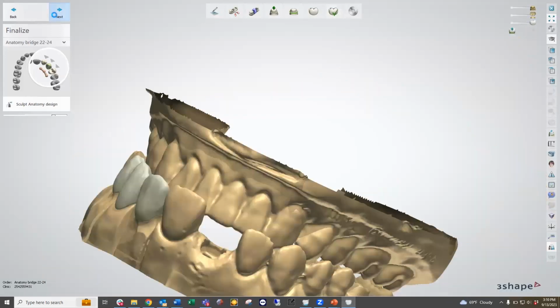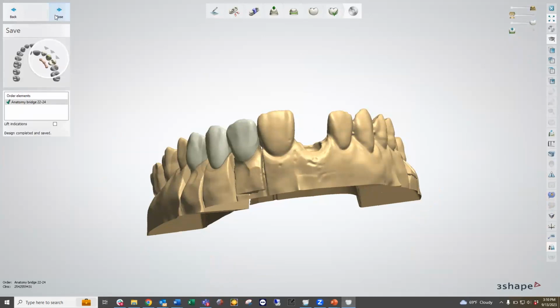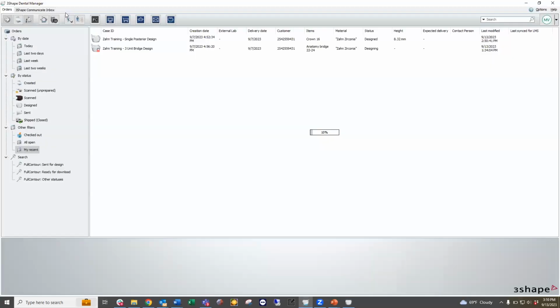So after the bridge is done, we hit next. It's going to again analyze to make sure there's no issues with the unit itself. If there's any issues, it will present itself at this time, and you have to make those adjustments in previous stages. Once we're all done, we're going to hit close, and we're good to go.